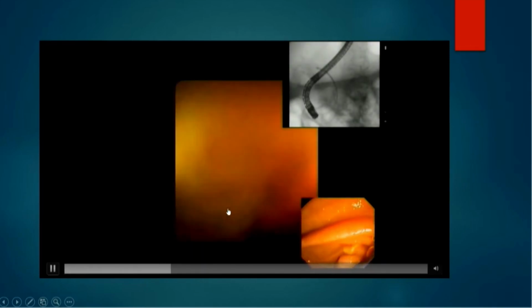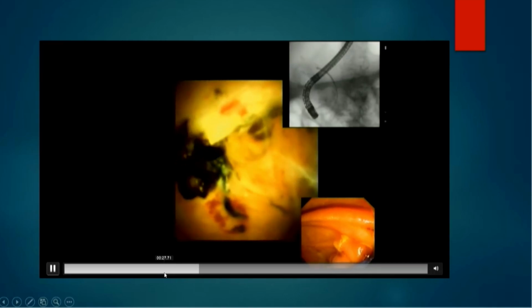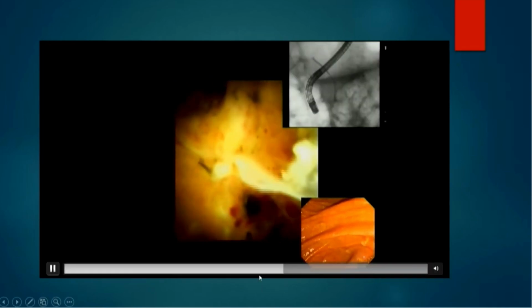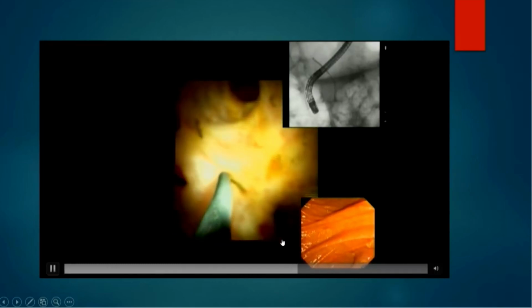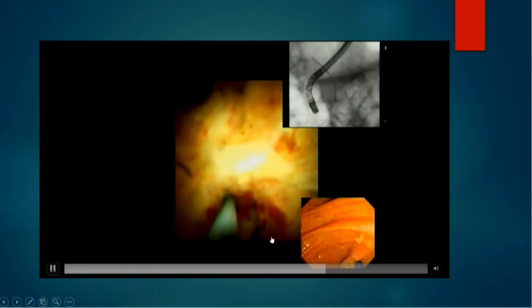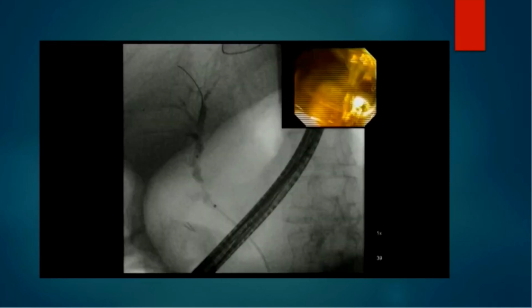And so in some of these cases, increasingly, we also utilize cholangioscopic access, and I'll show you why that makes sense, because typically we will just probe and reprobe with our guide wire, and sometimes never find the orifice. So here, if we try that hole, that's one of the cystic duct remnants, which is where the wire is most likely to go. And then the real anastomosis is down here. You can appreciate that if you just stochastically probe with your wire blindly, you may never hit that little hole. So in these cases of anastomotic strictures, increasingly we are helped by cholangioscopic assessment and access.